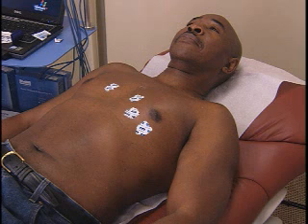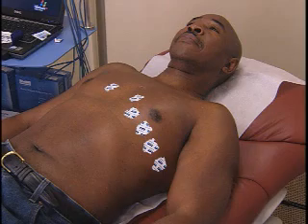V3. Place the electrode midway between V2 and V4 on top of the fifth rib. V5. Place the electrode at the horizontal level of V4 at the anterior axillary line. V6. Place the electrode on the horizontal level of V4 and V5 at the mid-axillary line.